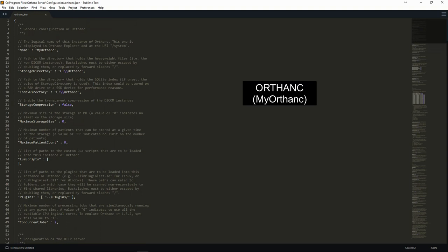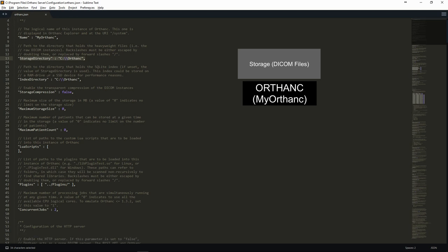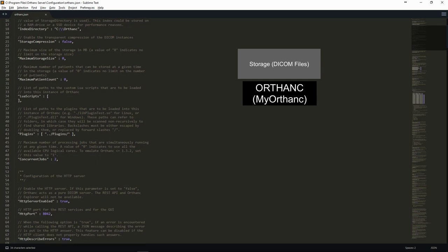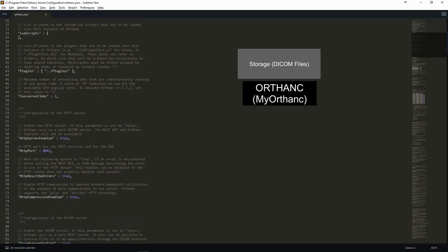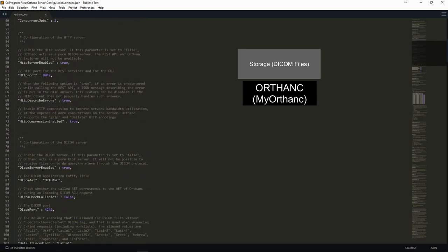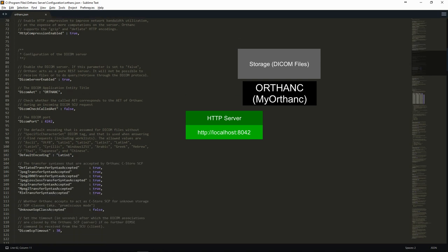First, it defines a name for the server which will be displayed in the web interface. Next, we can use the storage directory option to configure where Orthanc will store incoming DICOM files. You can also find in this file the configuration of the HTTP server with the port on which it will listen. We always have to make sure not to use a port that is used by another program.